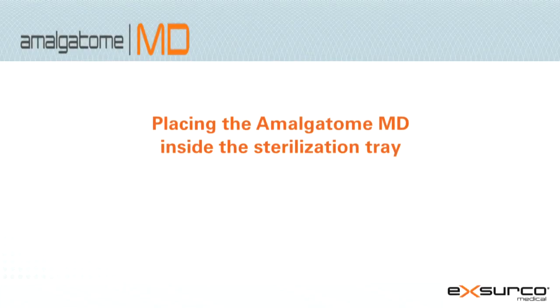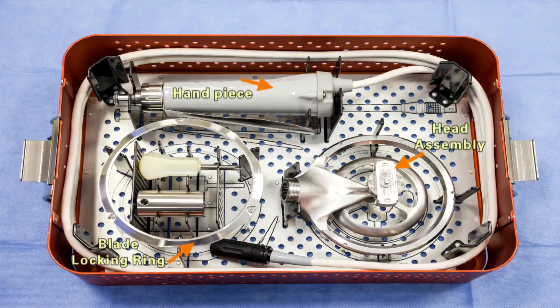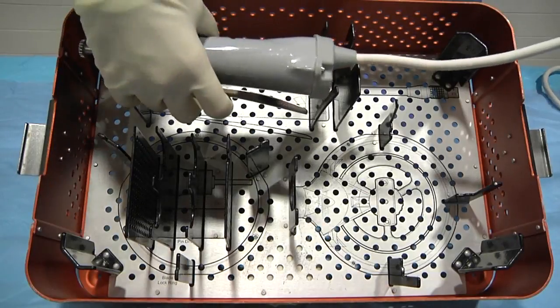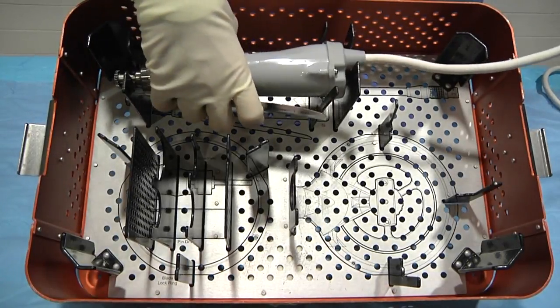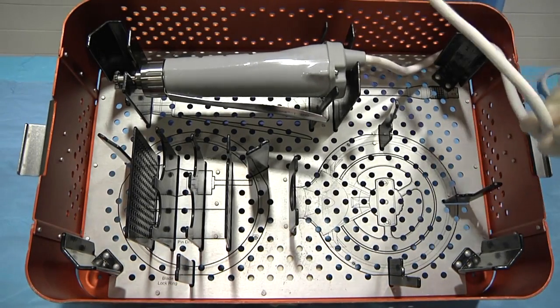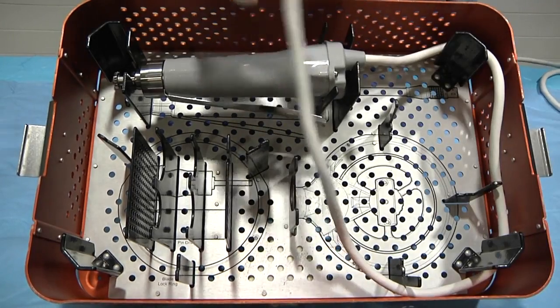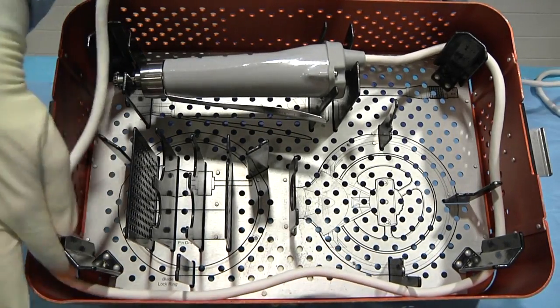Placing Amalgatome MD inside the sterilization tray. After disinfecting, place the handpiece, head assembly, blade locking ring, screwdriver, and pin driver into the Amalgatome MD sterilization tray. Note: as the power cord is wrapped around the outside of the tray, make sure not to apply too much tension at the corners of the tray.